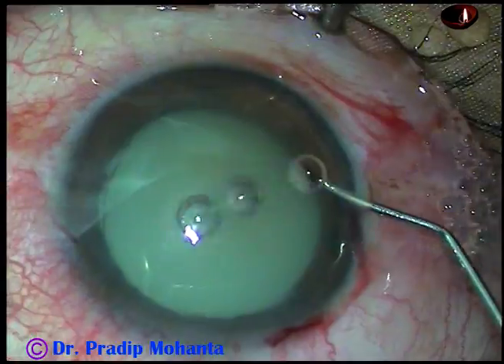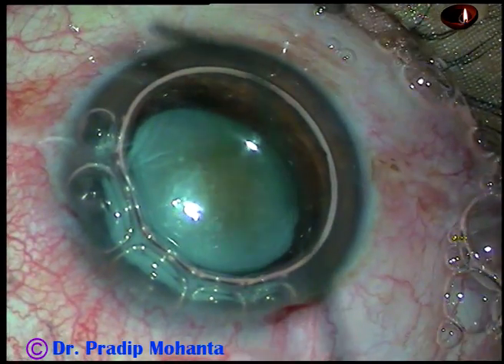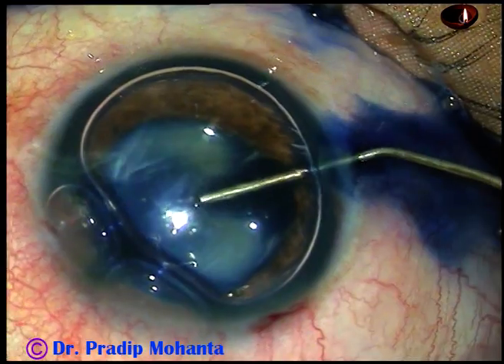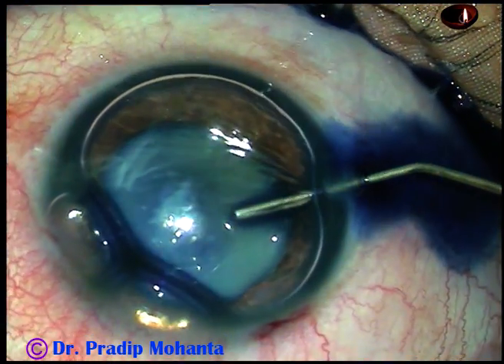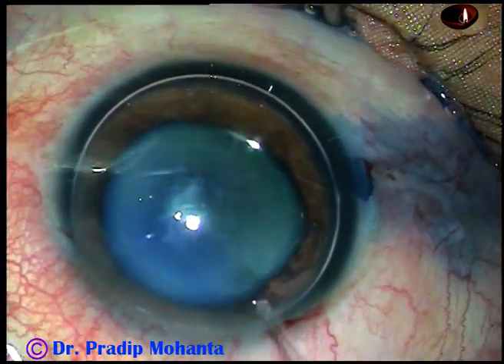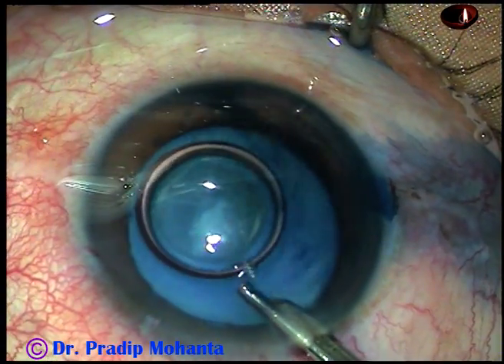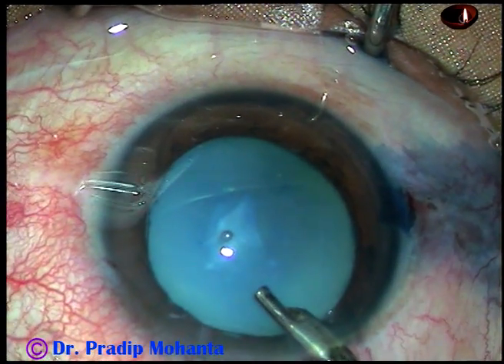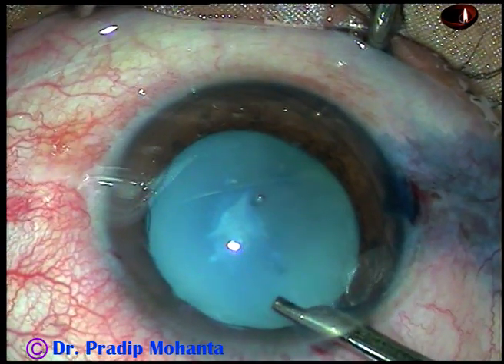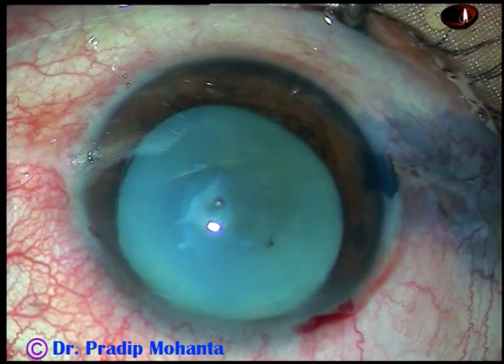Now, an air bubble is being injected into the anterior chamber. I want to stain the anterior capsule underneath this air bubble — and here goes trypan blue dye. The dye should touch all parts of the anterior capsule. Now we can see something white on the anterior capsule. Let us wash the dye out and see what is there. Yes, there is a fibrous plaque involving the anterior capsule.